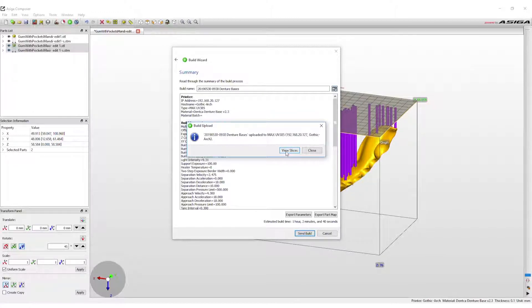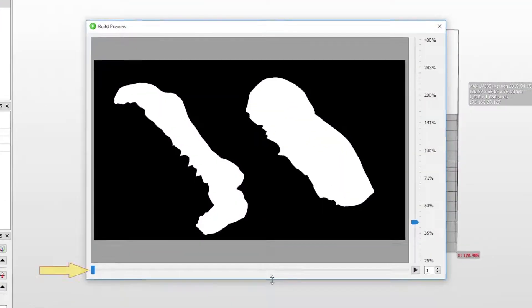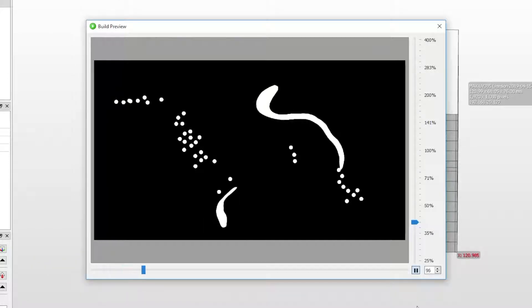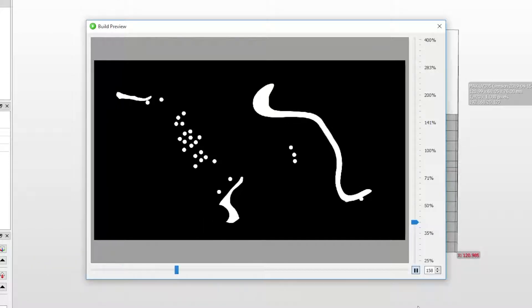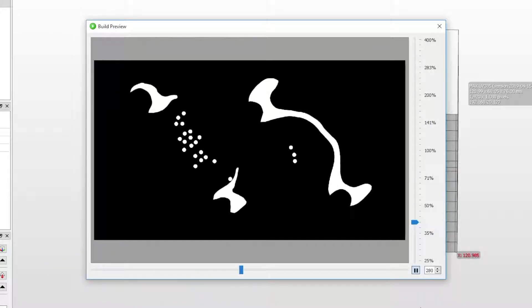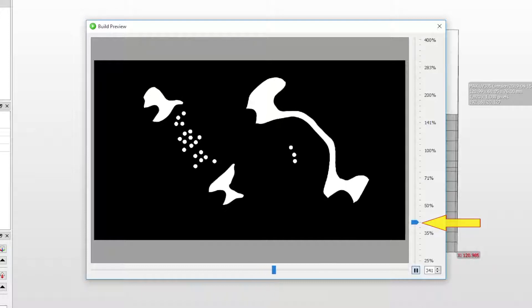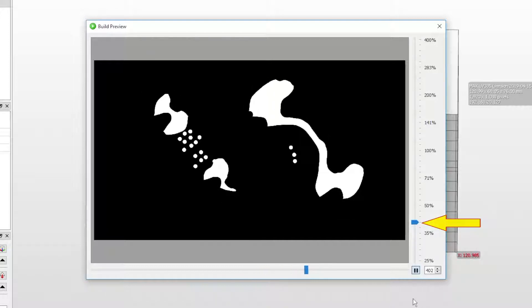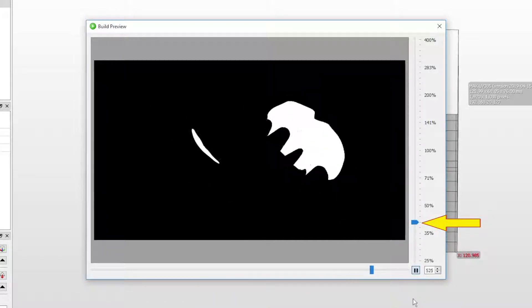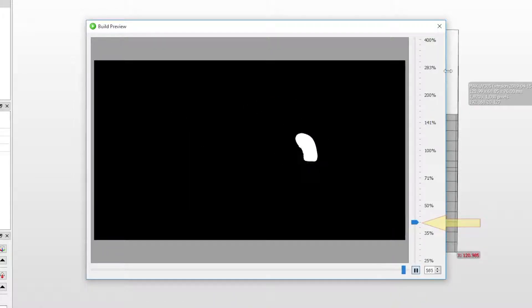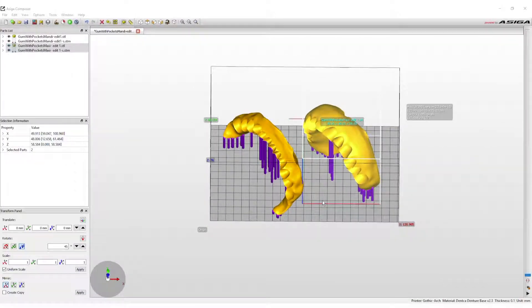When the build is submitted to the printer, the slices or layers of the build can now be viewed. In the build preview, the progress arrow along the bottom of the window can be moved to see exactly how the layers will be built in the printer. The slide on the right side allows you to zoom in and out of the print view. The printer will now complete the run process.